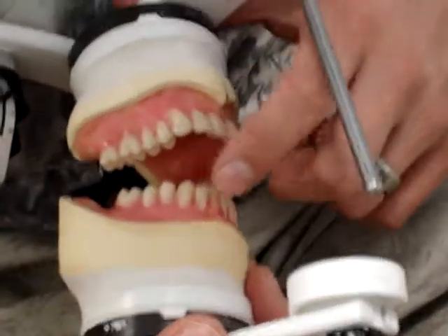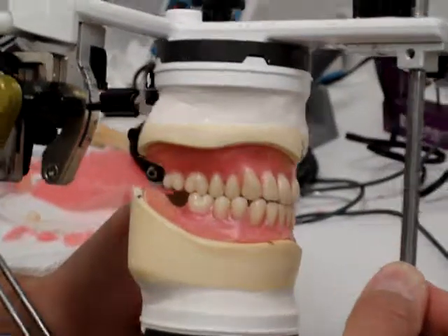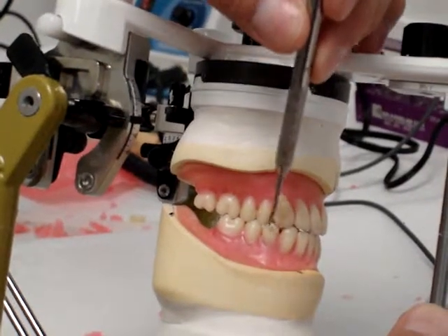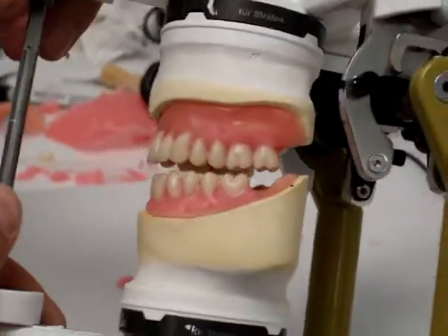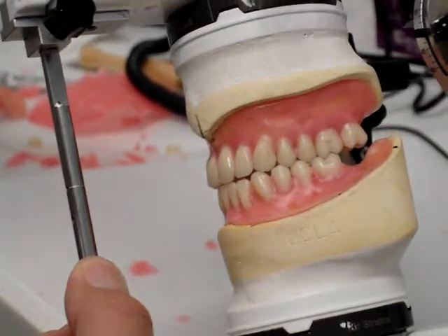I moved the mandibular canines a little bit, and when we go into excursives, you can see that I brought them up to touch the maxillary canine. So now we have excursive contact here, excursive contact there, and there. Same on the other side — I did exactly the same thing — and now you can see we have excursive contact there, and there.